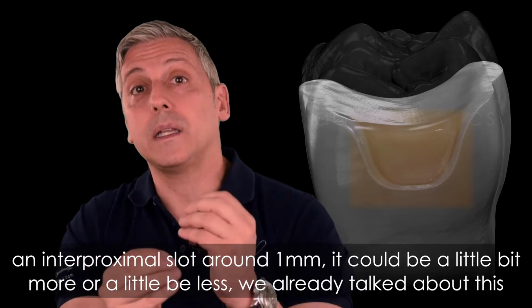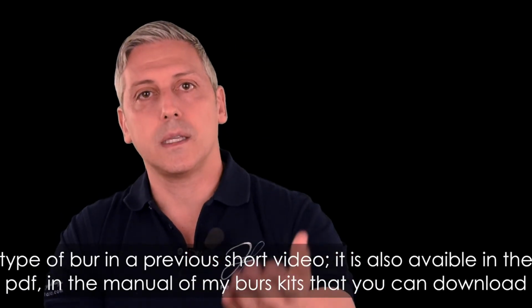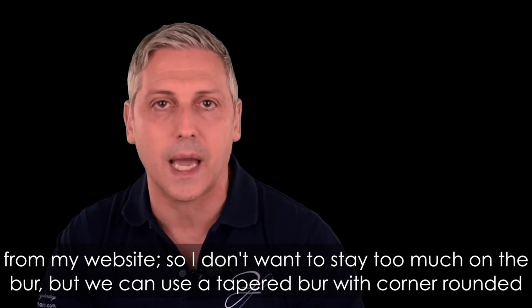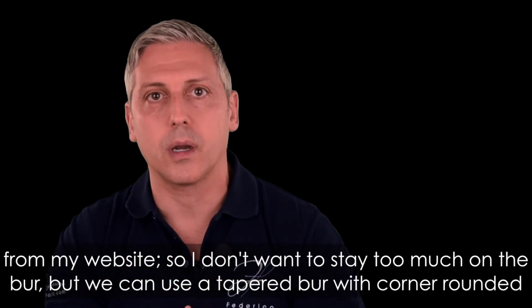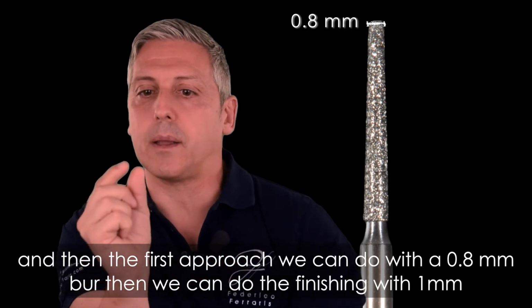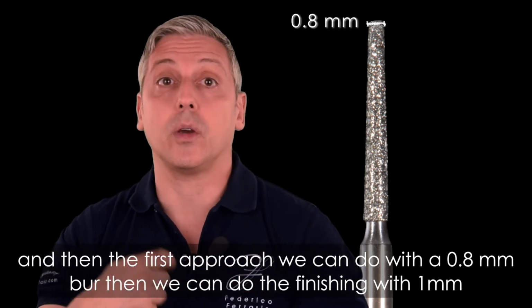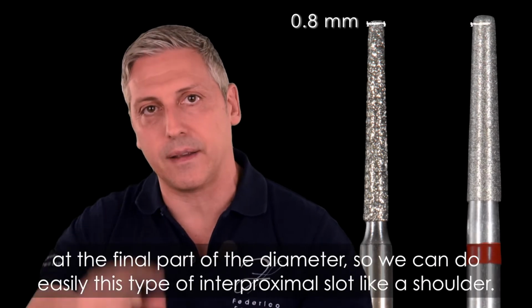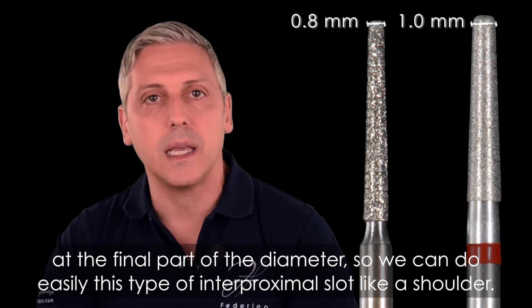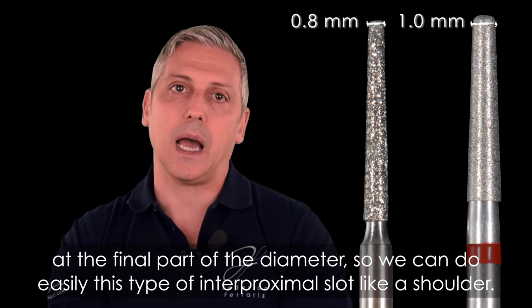Around 1 millimeter, could be a little bit more, could be a little bit less. We already talked about this type of burr in a previous short video. It is also available in the PDF, in the manual of my burr kits that you can download from my website. So I don't want to stay too much on the burr, but we can use a tapered burr with a rounded corner, and the first approach we can do with a 0.8 burr. Then we can do the finishing with a 1 millimeter at the apex, at the final part of the diameter, and so we can easily do this type of interproximal slot like a shoulder.